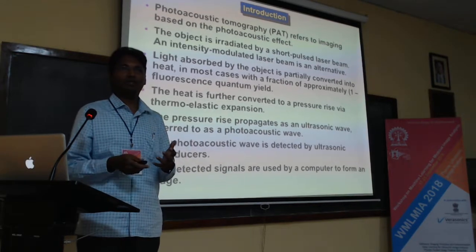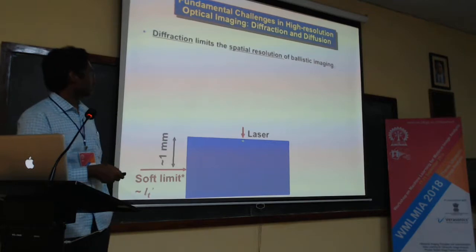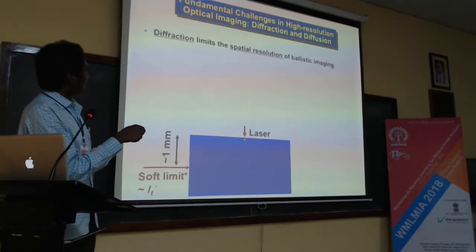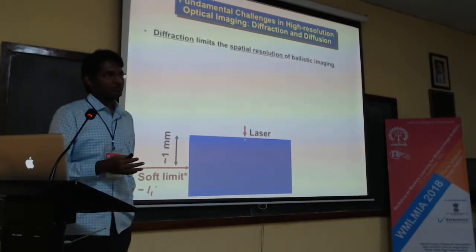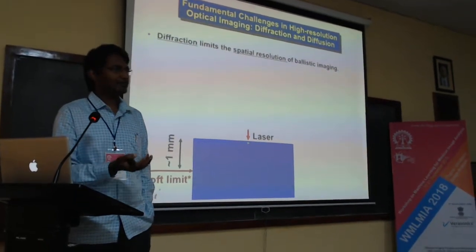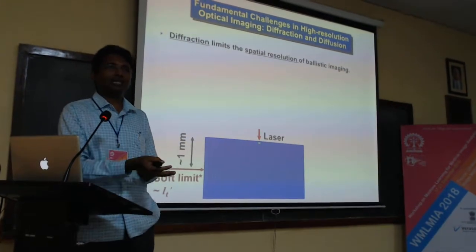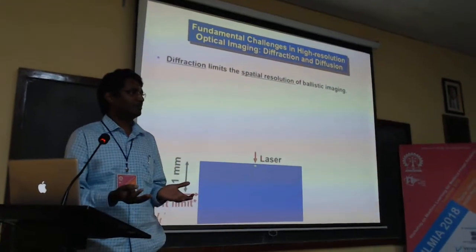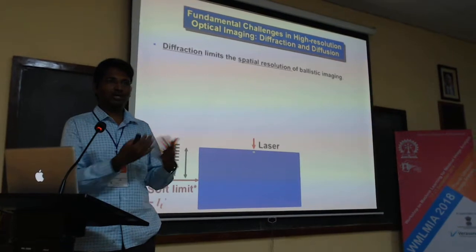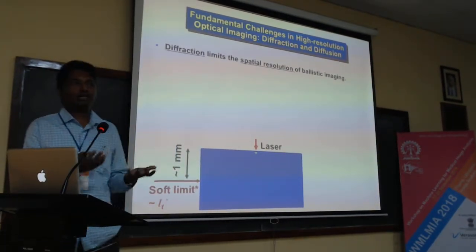Then we'll go into a little more detail about what happens at every physics level. So mainly the question is, why is the photoacoustic effect itself required? Why not send the light and detect the light? That would make it a lot easier, right? Why do you want to send the light and detect the sound? It doesn't make any sense, right? You can detect the light as well. Why not detect only the light so that you are done with it?